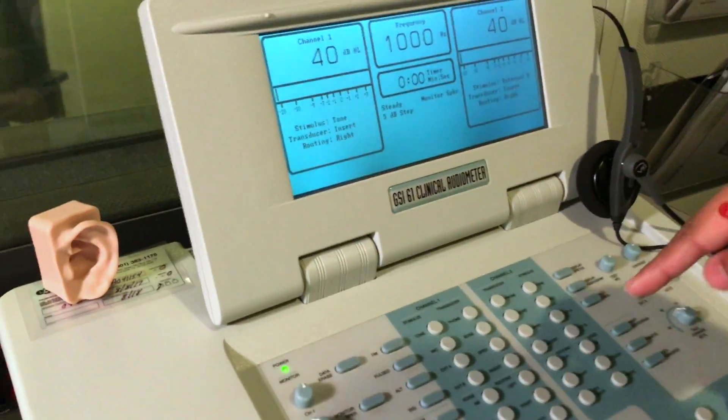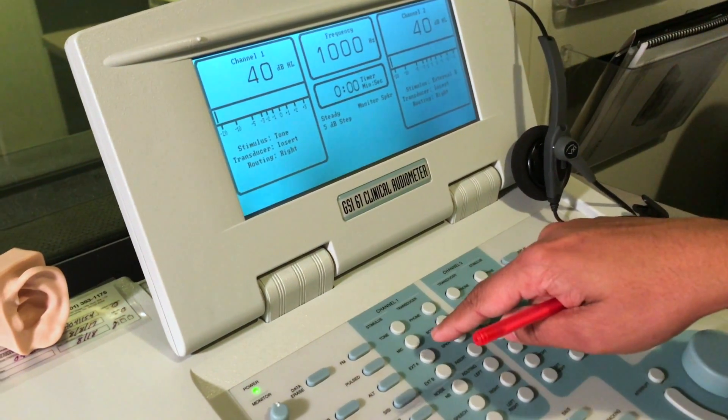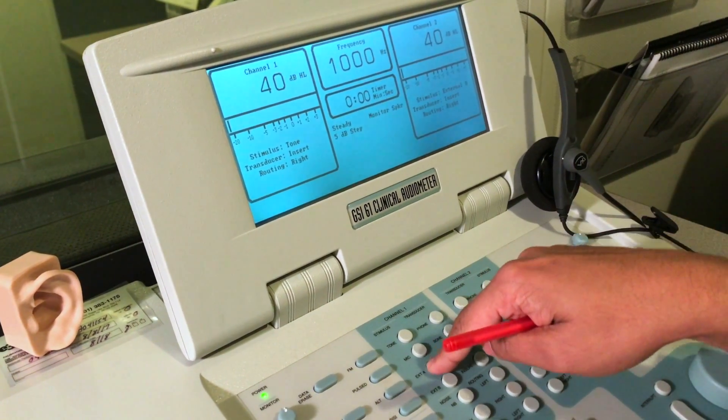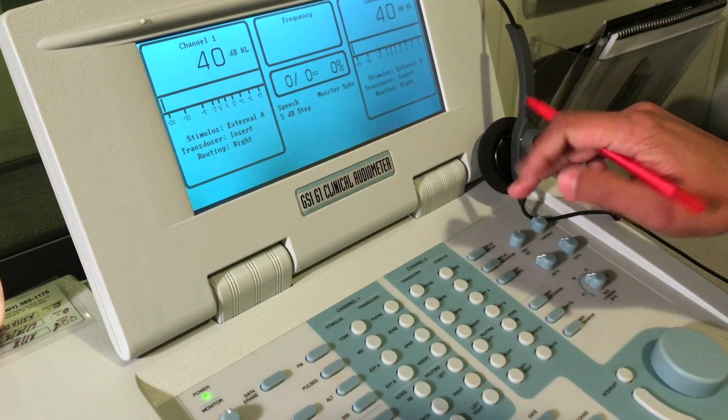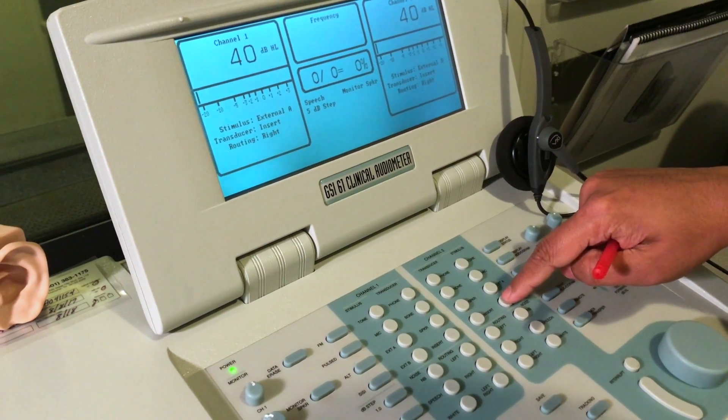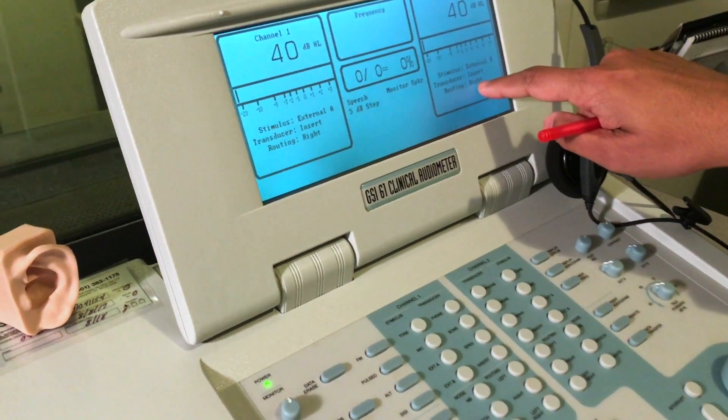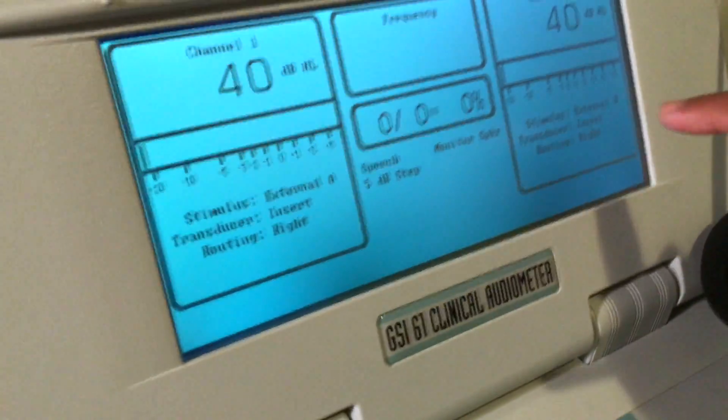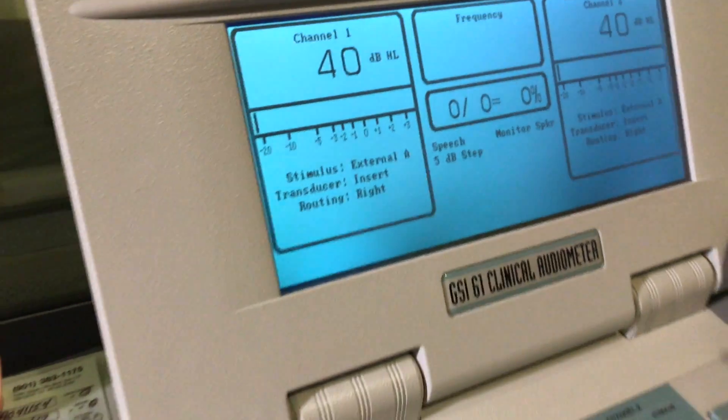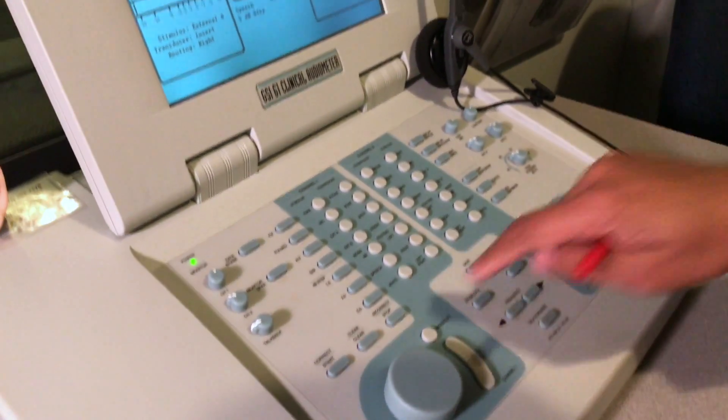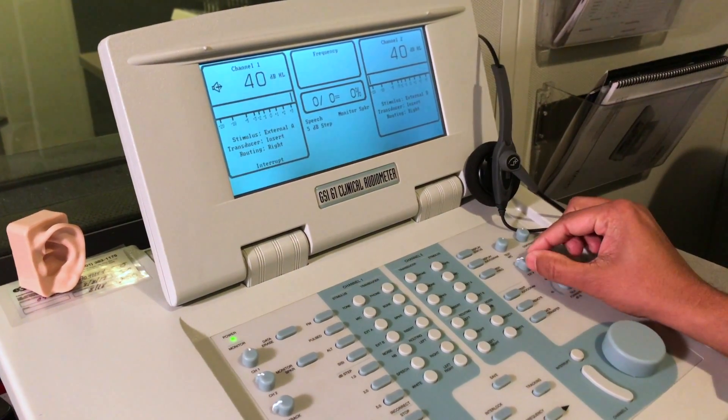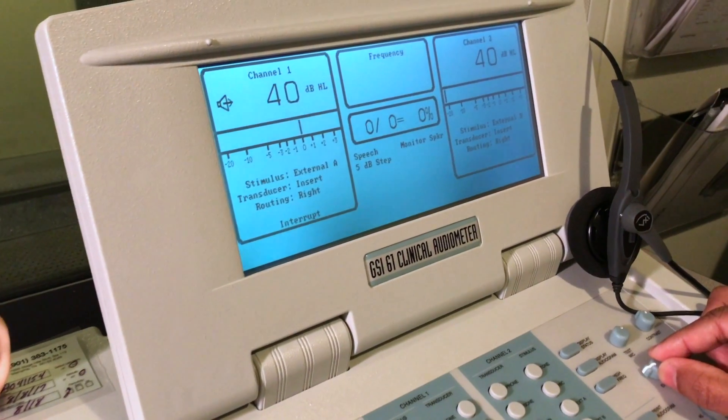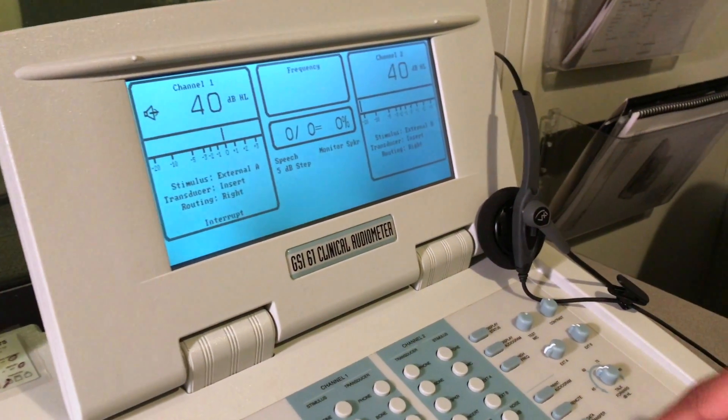Use that to set the VU meter to zero. On channel 1, select external A insert for the right ear. We're measuring the threshold in the right ear. On channel 2, select external B insert, and make sure you select the same ear. Both the noise and the tone should be presented to the right ear. Press interrupt to make sure it's playing a tone, and then adjust the VU meter so that it is zero. Repeat the same for channel 2.